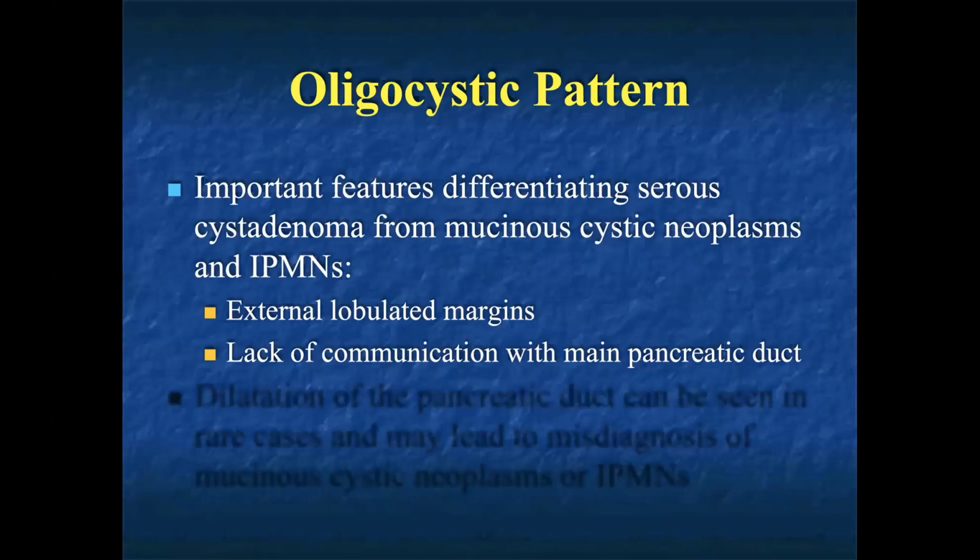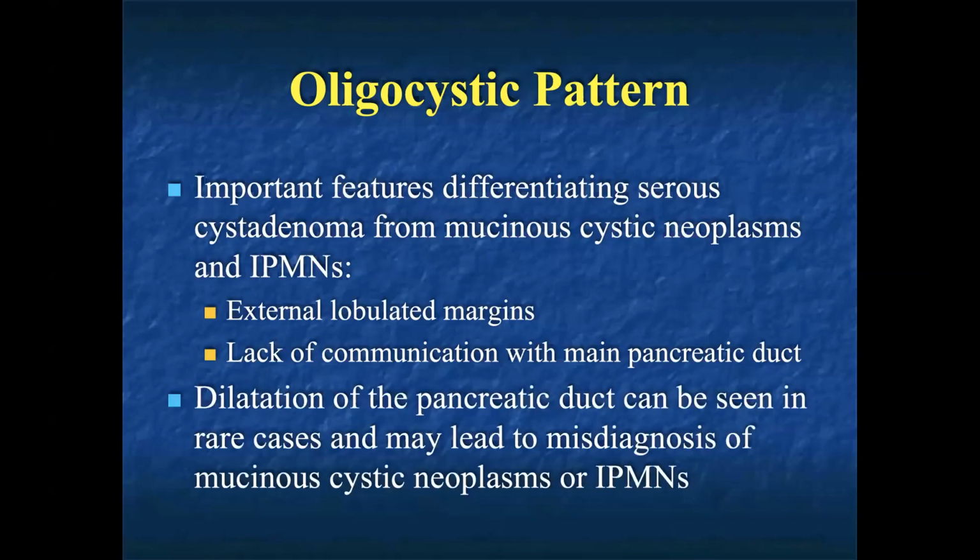One thing with serous cystadenomas, they classically say there's no duct dilatation, and that's very true, but occasionally you can have duct dilatation. So if you see a pancreatic duct dilated, don't let that bother you, okay? That becomes very important, all right?